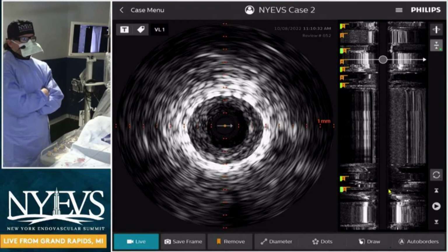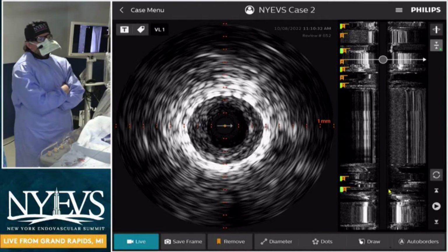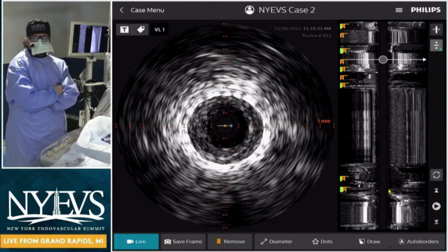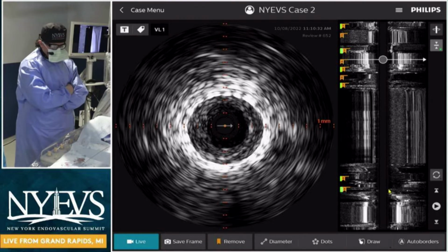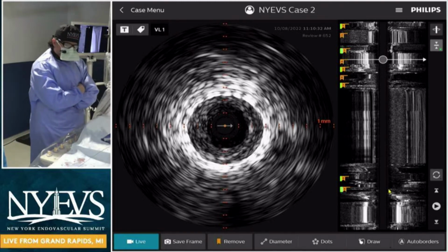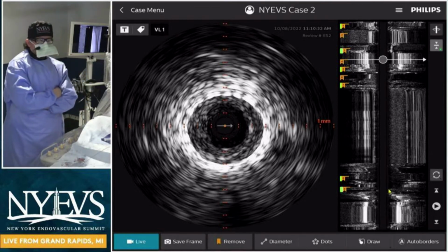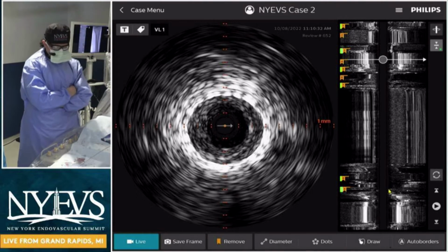But Fadi, there's a lot of talk on IVUS, and I just want to bring this up to the panel. I know Dr. Tamala and I have talked offline about this. Without any hard data, we have no hard data. In coronaries, in left main, I can tell you over and over again, there are really hard outcomes with IVUS. We don't have that here. Are we just spinning our wheels and having a lot of opinions on what we see without outcomes? Don't we need to push Philips or other companies to say, hey, we need to do a trial to have some hard outcomes so that we can use your product?